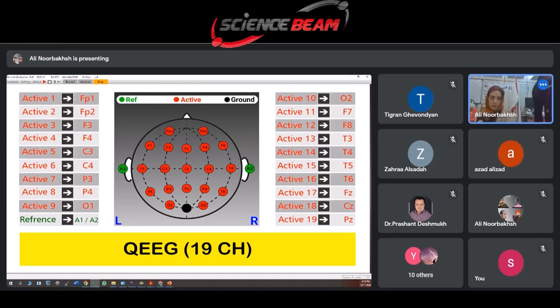Now the subject is ready. First, we should measure according to the 10-20 system.